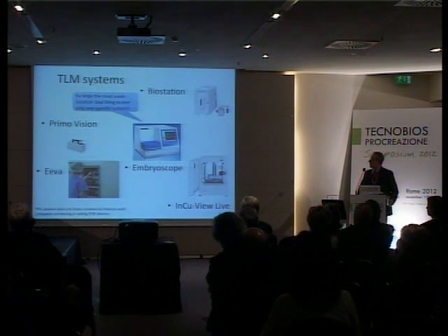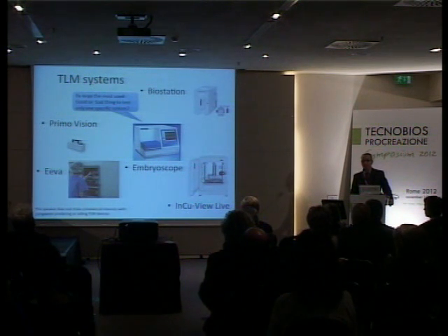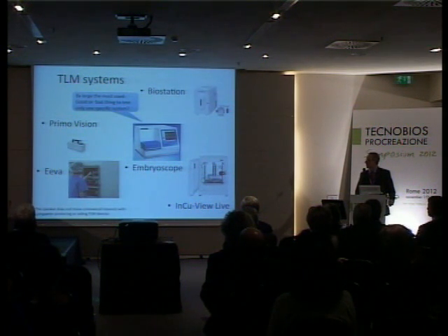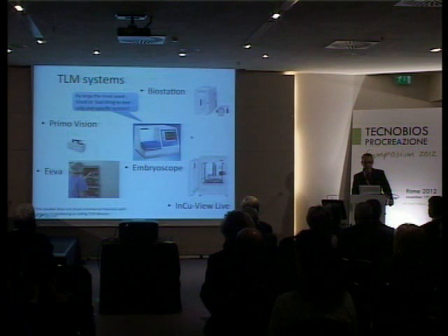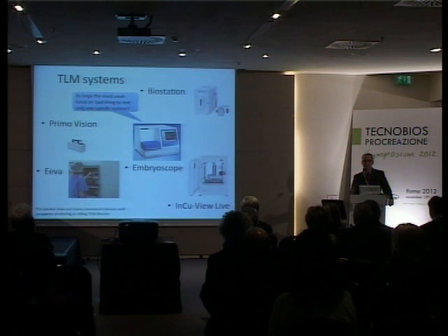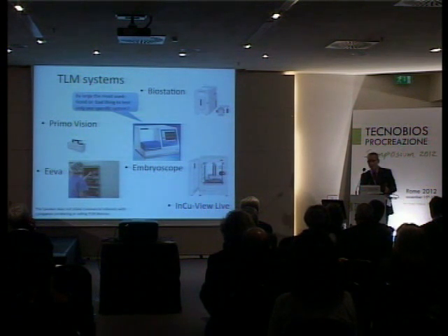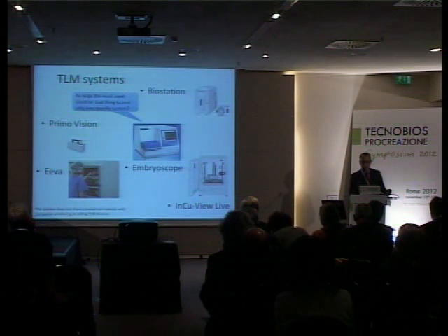So we now have a number of time-lapse microscopy systems. Companies have become interested in that. And by far, the most popular one is the one in the middle here, for a number of reasons that I'm not going to explain. But there are advantages and drawbacks in having a single or predominant system, because on one hand we can better standardize observation with the same device and the same technology.